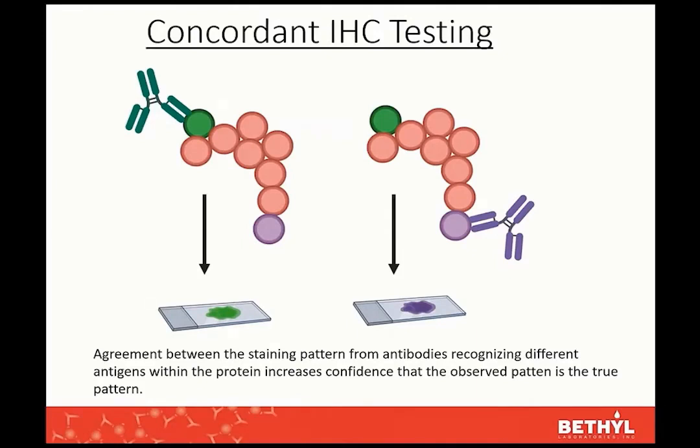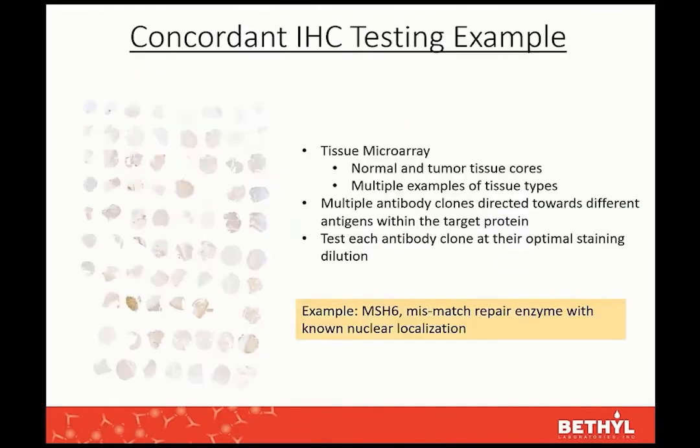Now, you notice I've not said anywhere that this proves that the pattern is true. All these methods are built around increasing your confidence. When you start saying that you've proven that this is the pattern, then it gets you in trouble down the road. But we build in methods that provide us ever increasing confidence that the antibody is on target and recognizes the protein it should recognize.